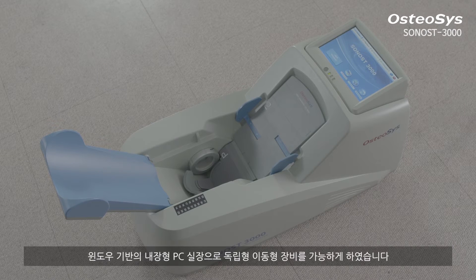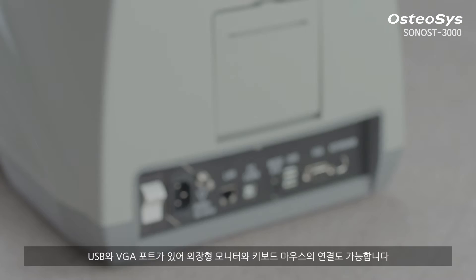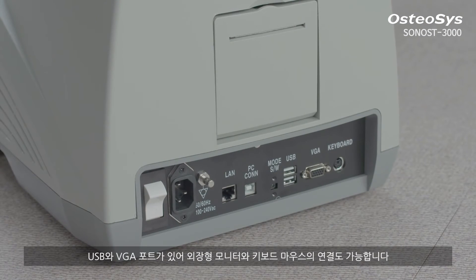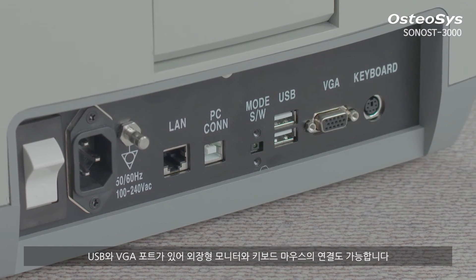A Windows-based embedded PC enables a stand-alone mobile device. Sonos 3000 can be connected to an external printer, monitor, keyboard, and a mouse by USB port and VGA connector.